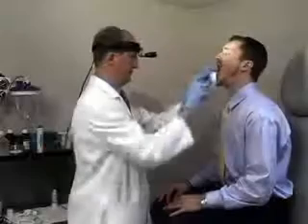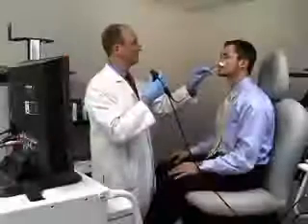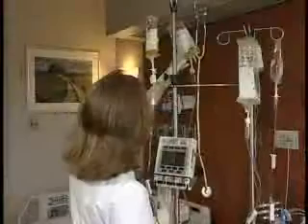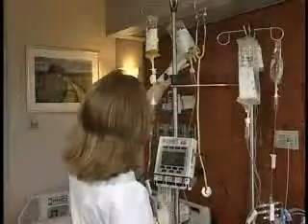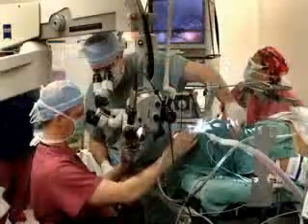Evaluation of the larynx and pharynx is an important part of a complete physical examination. Laryngoscopy by mirror or flexible fiber optic exam can safely be performed in the adult and pediatric population for benign or malignant conditions. With the advent of multidisciplinary care for head and neck cancer, knowledge of laryngoscopy and laryngopharyngeal anatomy is important in an increasing number of medical specialties.